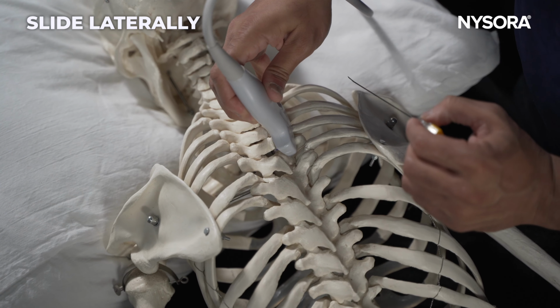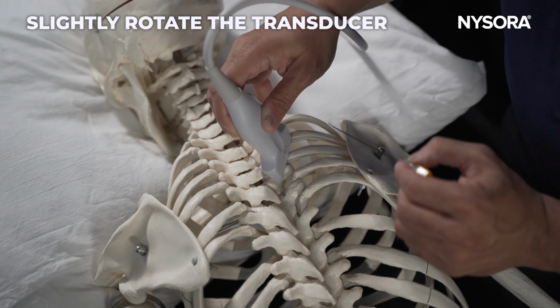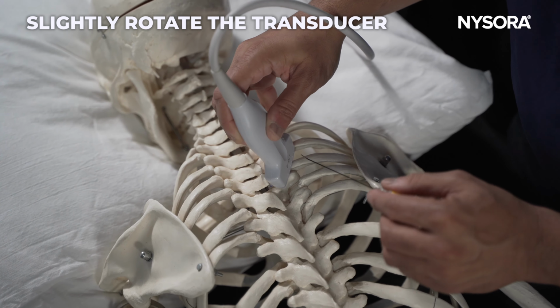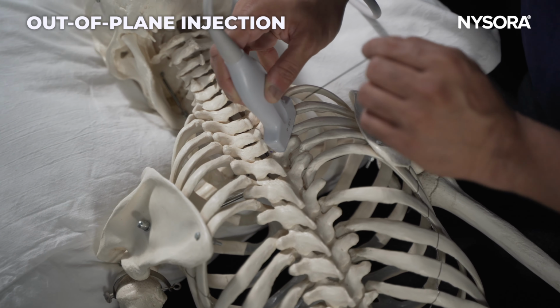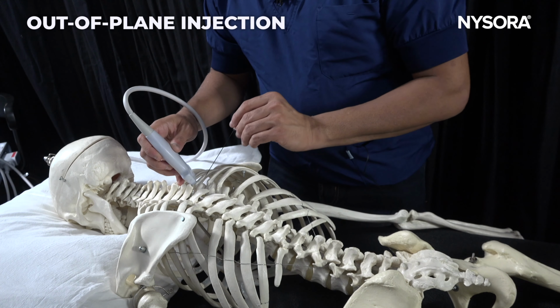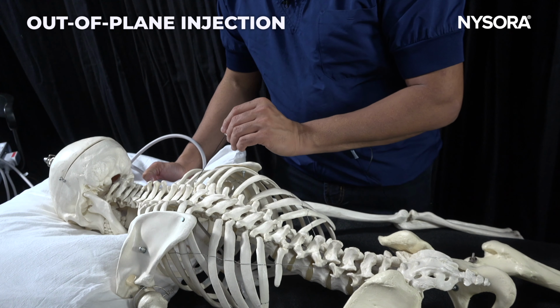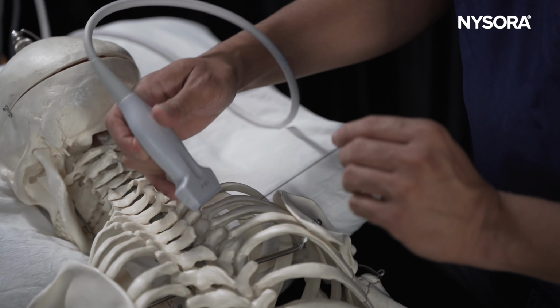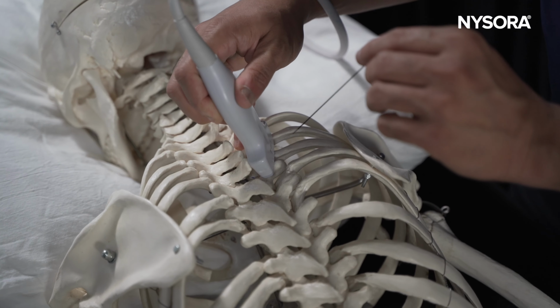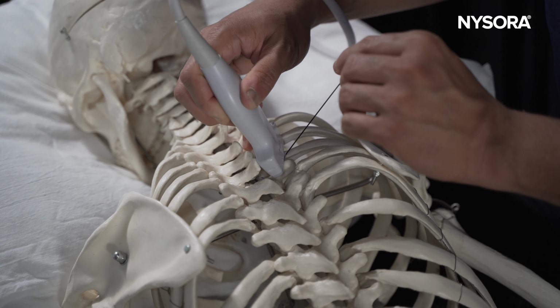Once you have located this gap, the next step would be to move the ultrasound probe slightly horizontal, and you can then target or inject this joint using an out-of-plane technique. One of the ligamentous structures that are very important when you're performing this injection is the lateral costotransverse ligament, which you'll be able to identify on the ultrasound guidance, and targeting the joint with the local anesthetic and steroid.